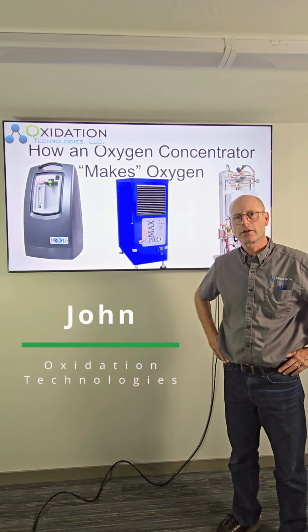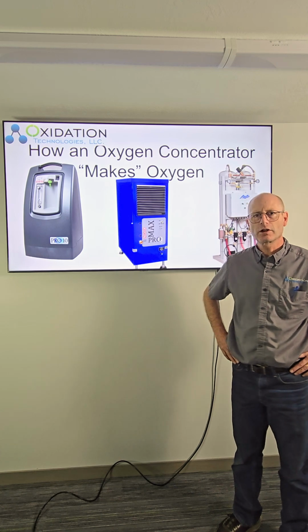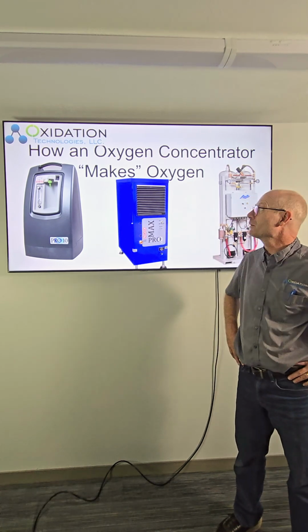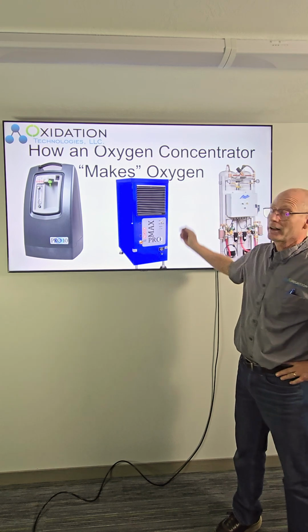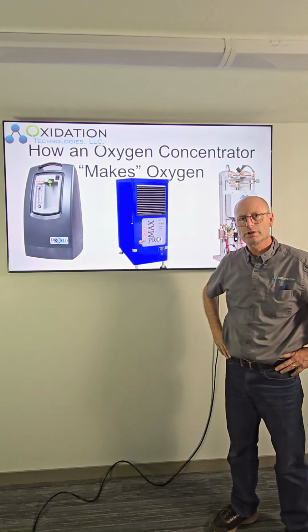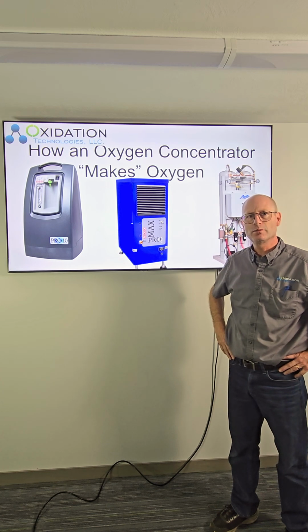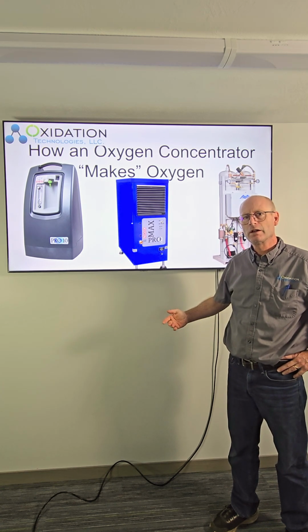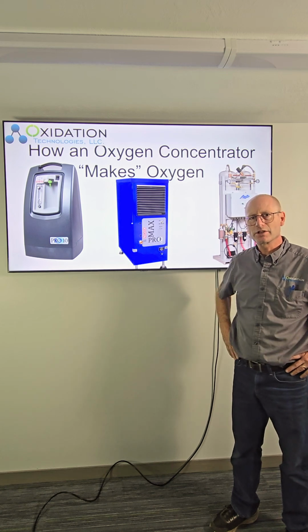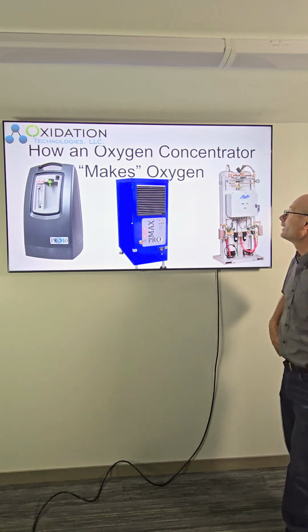Hi, I'm John from Oxidation Technologies, and I'd like to talk to you today about oxygen concentrators and how they "make" oxygen. Now, I put "makes" in quotation marks because we're really not making oxygen, but we're taking air and removing the nitrogen and concentrating the oxygen that's already in the air.